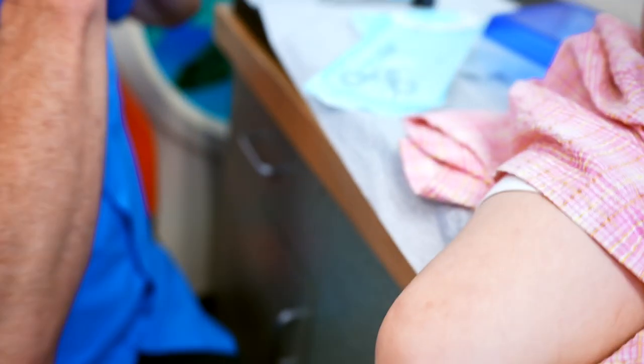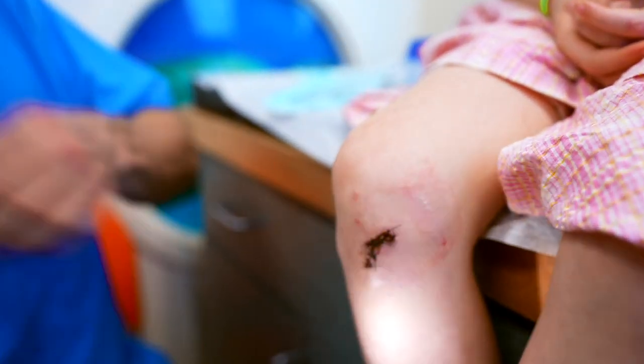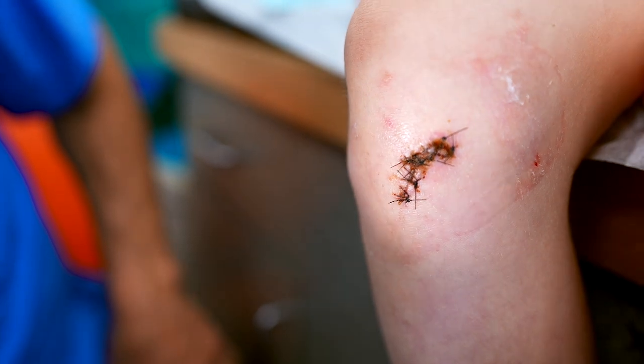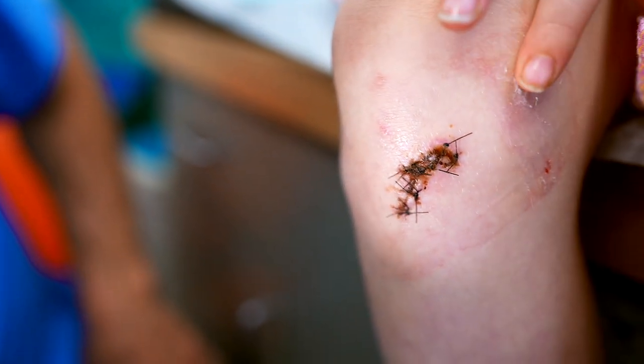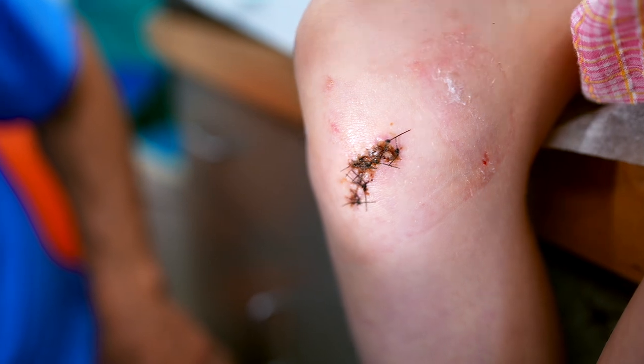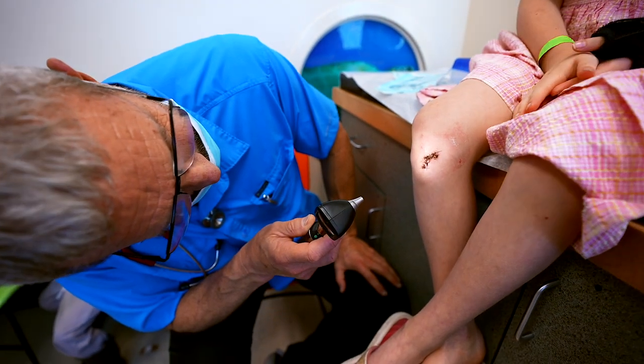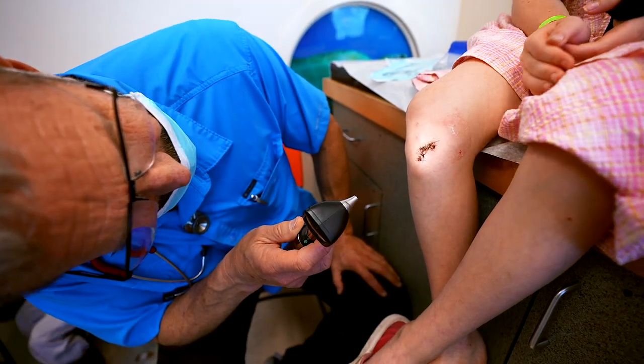I'm gonna sit right here and take a look at your owie. That's a cool looking owie. This is white bandaid stuff, and your bandaid stuff can be really hard. This is 12 days old, right? Yes. I think it's ready to come out.